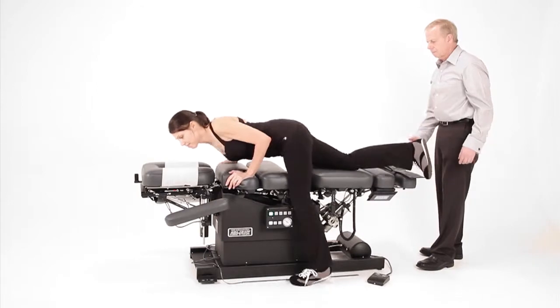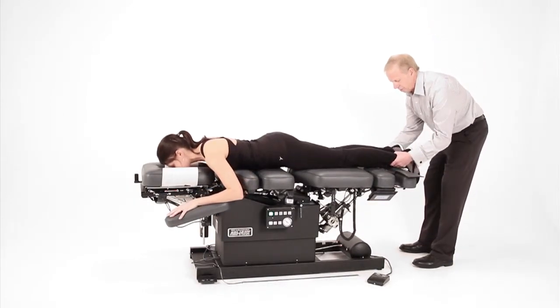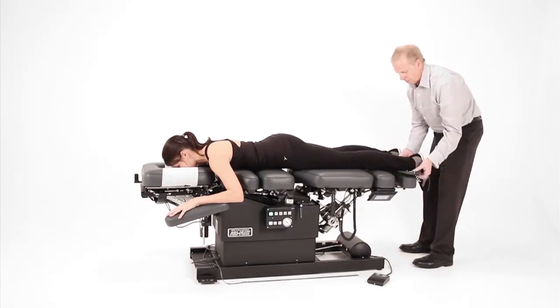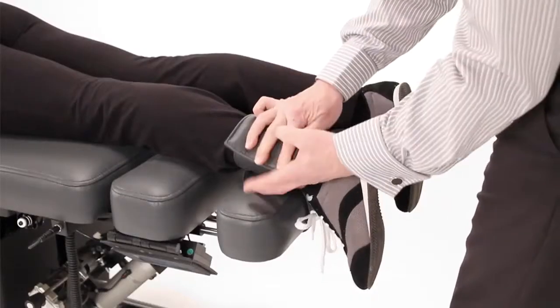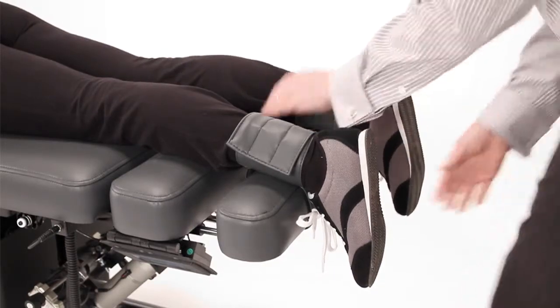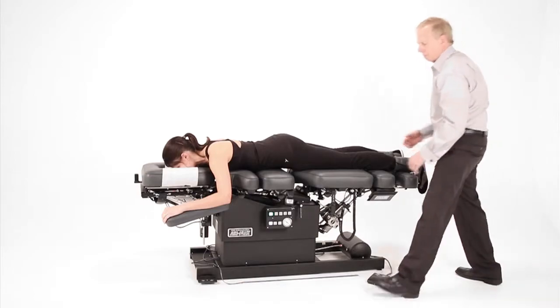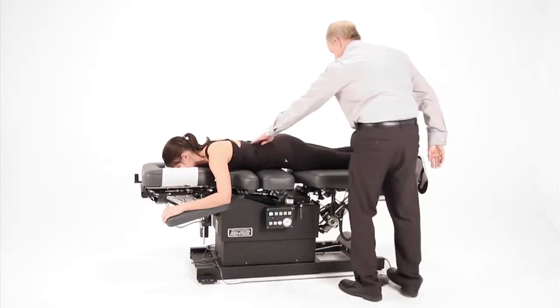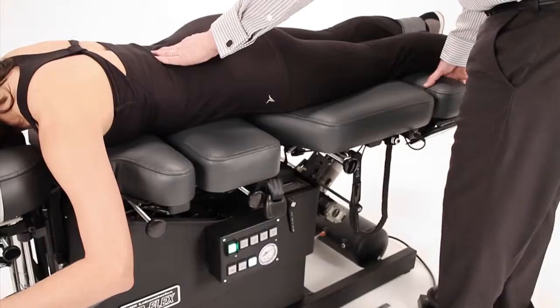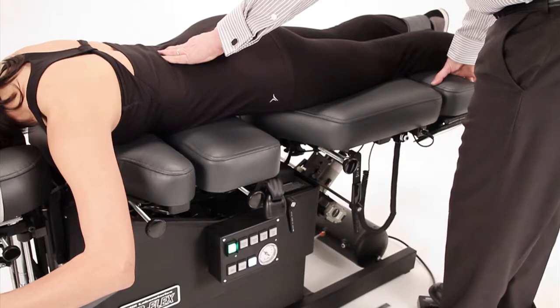Preparing a patient for a flexion treatment is easy. First, position your patient on the table and secure their ankles with the ankle straps. Pull the foot section out to tighten the slack. With the green power button on, select the distraction button and use the pressure pedal to distract your patient. Palpating the lumbar region will help determine the amount of distraction the patient is receiving.